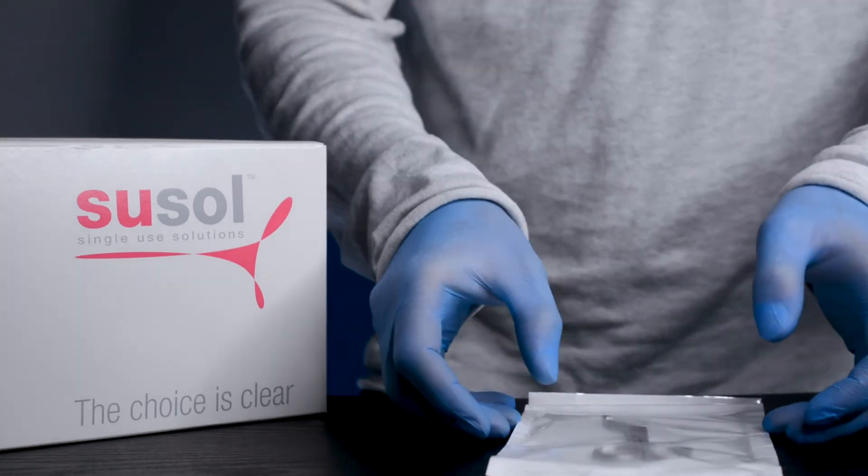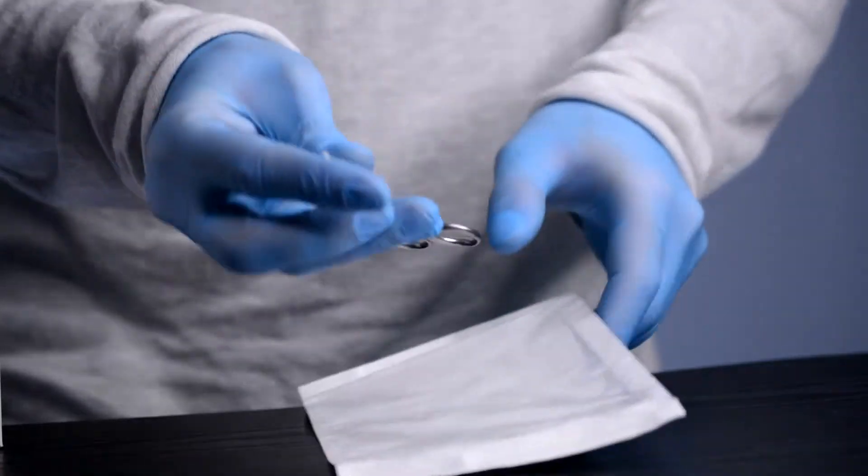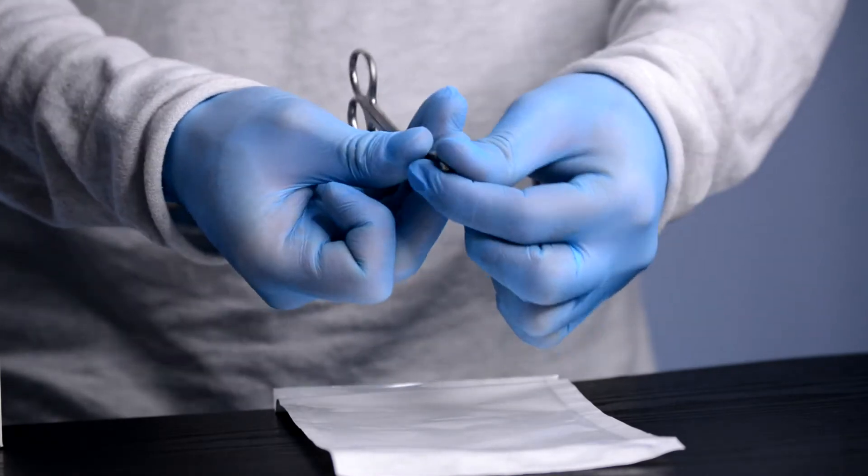Bandage scissors are used for cutting dressings. The blunt tip of the scissor helps to lift the bandage from the skin safely for easy bandage removal.